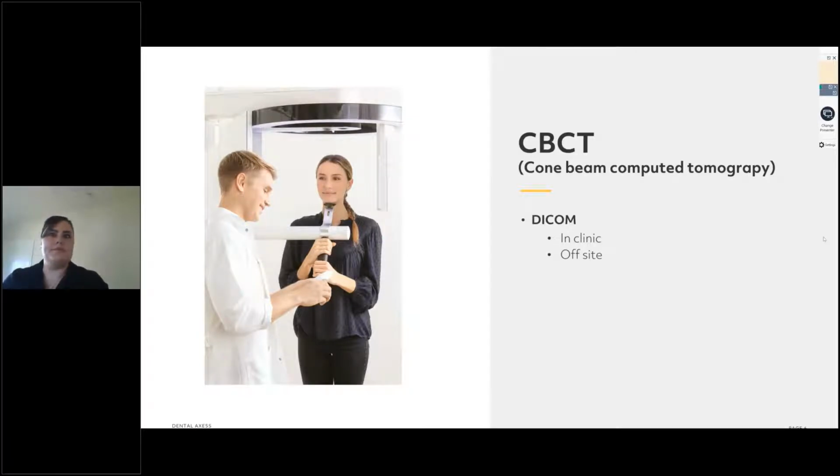So again, with your CBCT scan, now you might have one in your clinic. If not, you'll be sending your patient off site to have them done. But as long as you've received that DICOM file, that's all you need to be imported into the software.